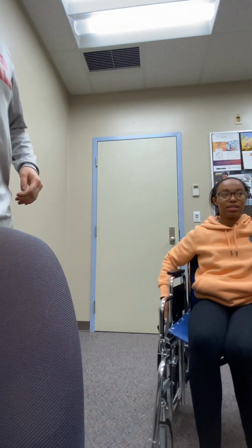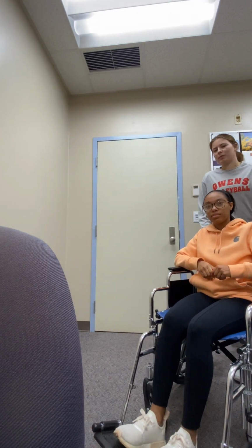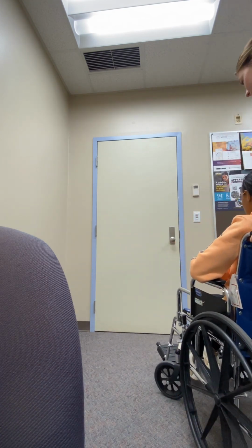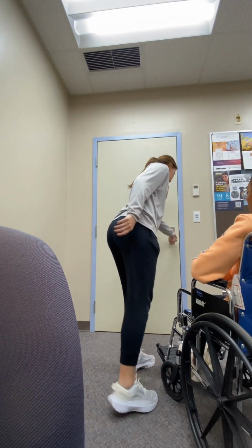Whenever you're ready. Alright. Next we're going to do assisted with the door opening towards the patient. So what you do is face the patient towards the edge of the door. Then you leave enough room so that the door can open all the way. Then push the patient through the door.